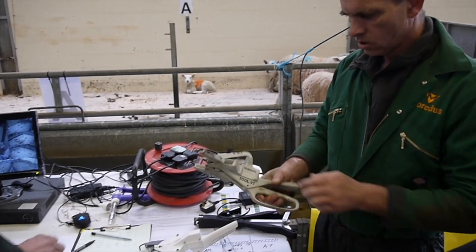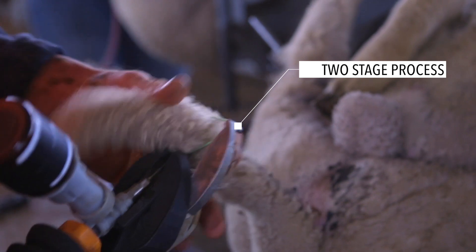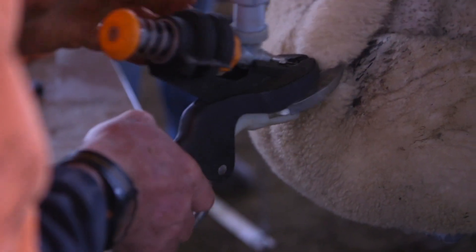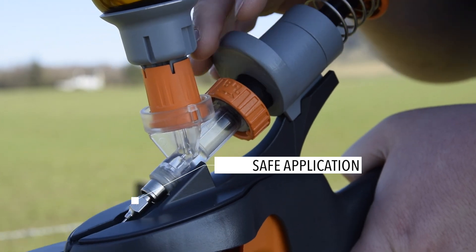We've worked hard to make a custom injector that works in two stages using a single button, with the band in place acting as a guide for the injector. The first stage moves the needle forwards out of its safe position and into the animal. Then as you continue to push the button, you deliver the dose. With one hand on the applicator and the other on the injector, both hands are always away from the needle.